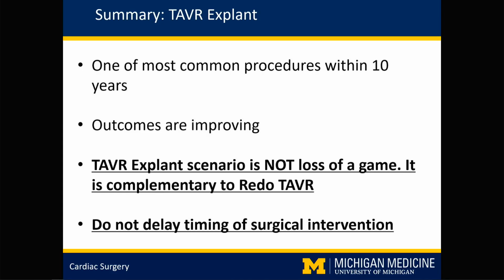And then you rotate the aorta to your face. And at that point, I use a 15 blade instead of doing all the turning. For me, the 15 blade is cause. I've had one patient with damage to the anterior leaflet of the mitral valve when I was doing a lot of twisting. But so now I use a 15 all the way through. So different styles of doing it.